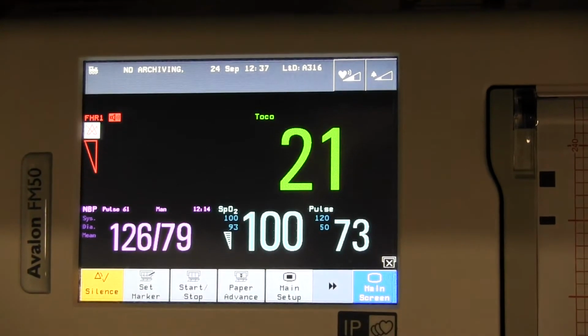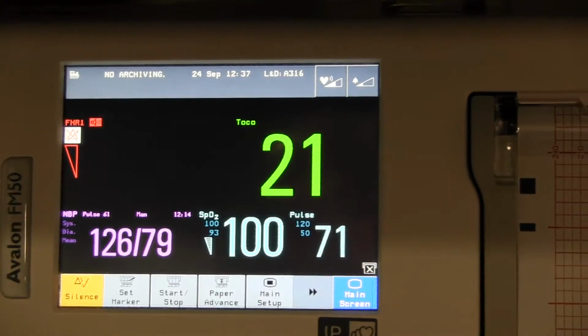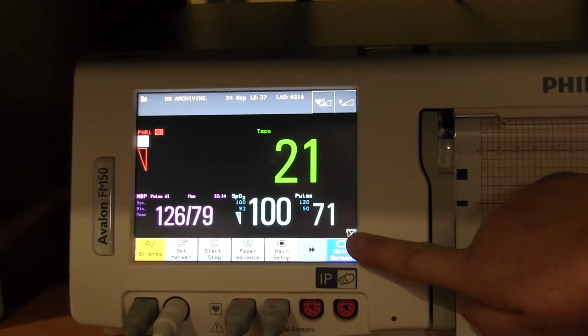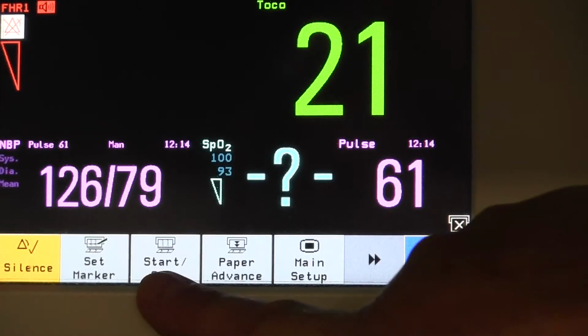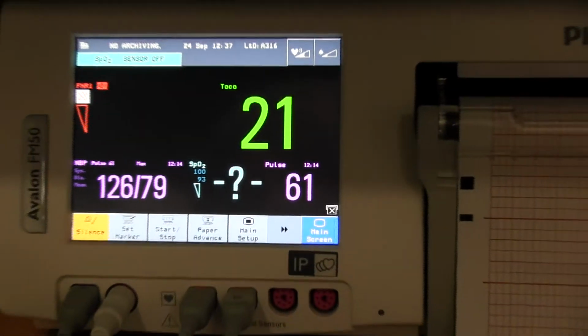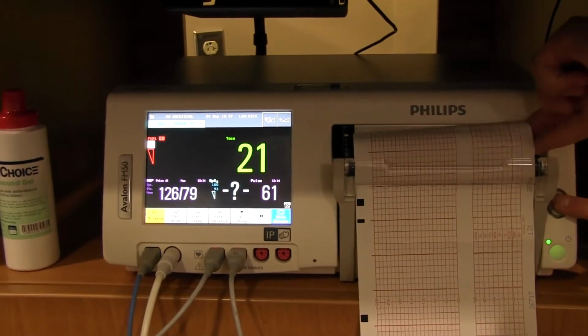All right, let's start using the monitor by loading the paper. The recorder must be turned off. The small icon above the main screen shows if the paper is off or on. Press the paper eject button to unlock the paper drawer. Remove the remaining paper from the tray.